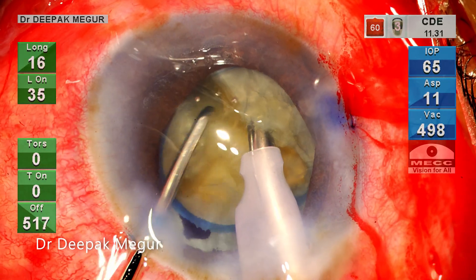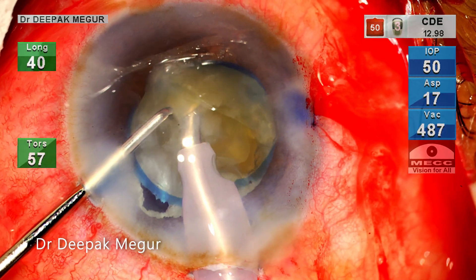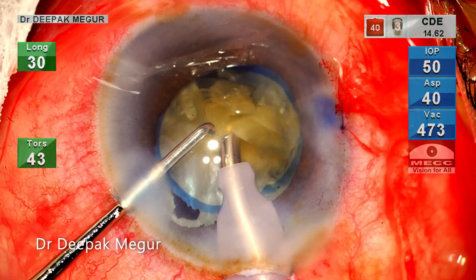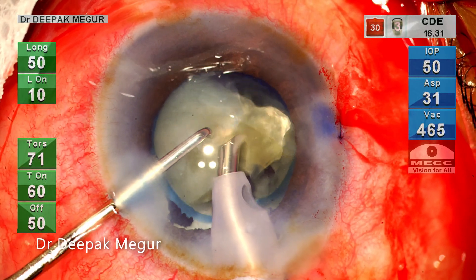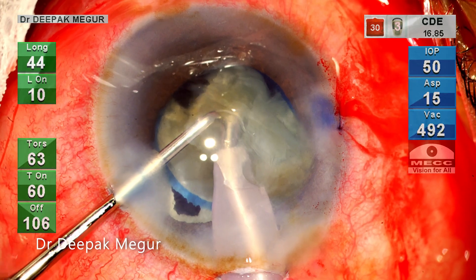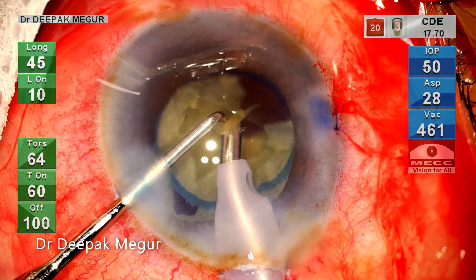The first hemi-nucleus is divided into three fragments — time to emulsify them. Since there is a lot of crowding in the anterior chamber, I need to ensure that there is minimal turbulence and chatter during fragment emulsification. Here I am using the burst mode of energy delivery to give better control over the emulsification process. The amount of energy delivered has to be controlled by the foot pedal.